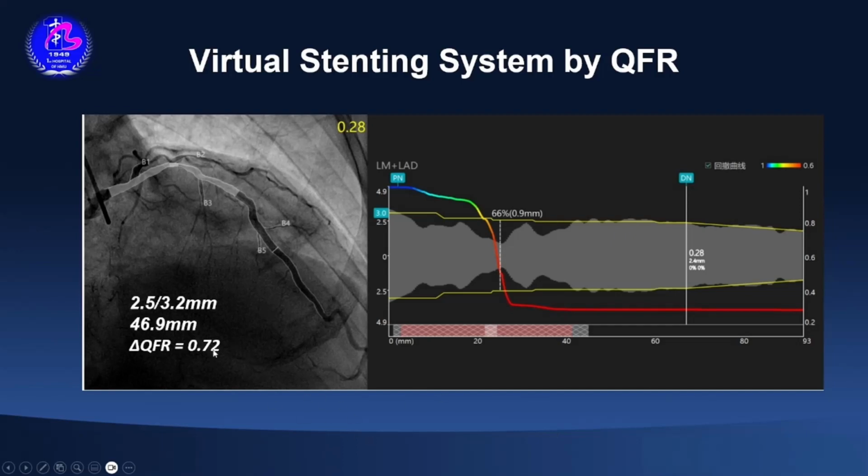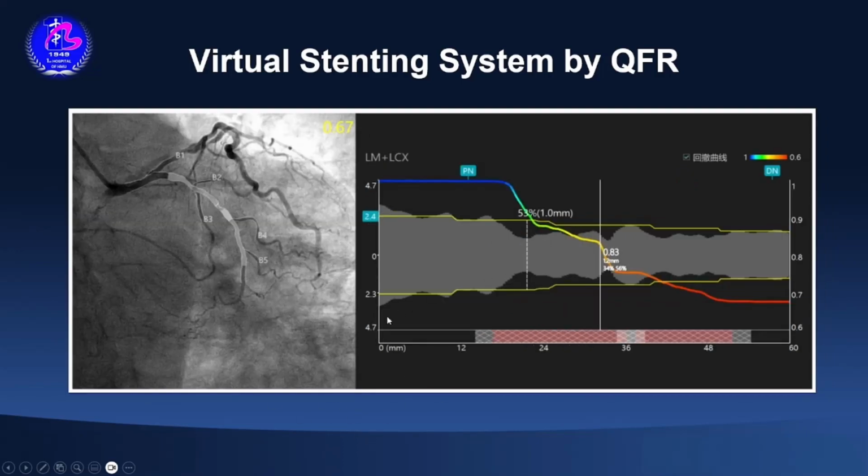Next. The QFR of the LCX may be increased from 0.67 to 1. It could help us to make a plan before the operation.